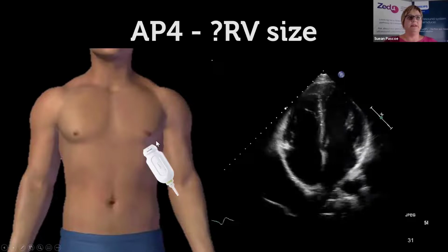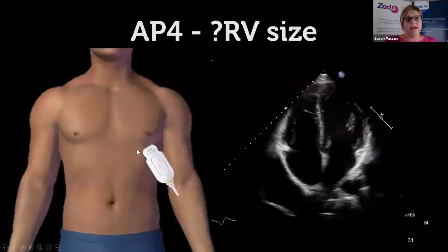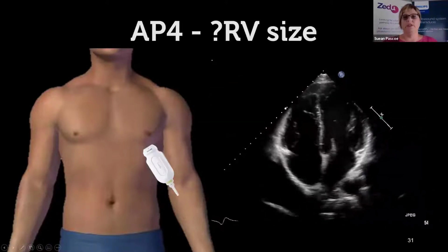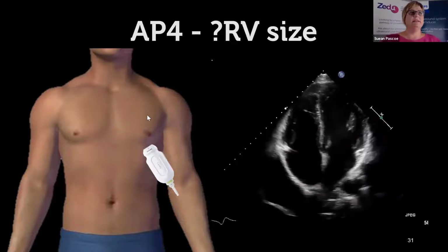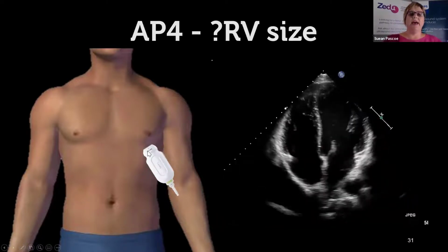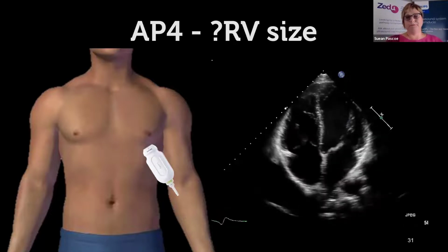So my advice here is pretend there's a drinks coaster, like you put your beer on, and you need to do a bit of a zigzag around here, about the size of a drinks coaster, to be able to find the window. Be adventurous. The other way I get to this window is from my parasternal long axis view. I bring the probe down to the apex of the heart, take my probe nice and flat, and then rotate it into that transverse positioning of the probe.